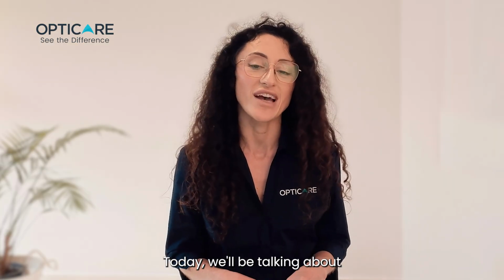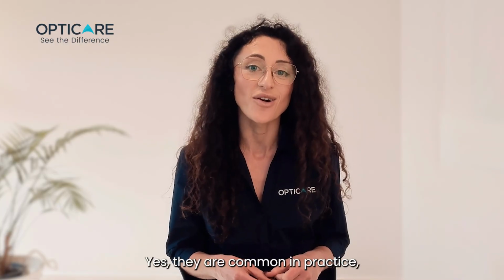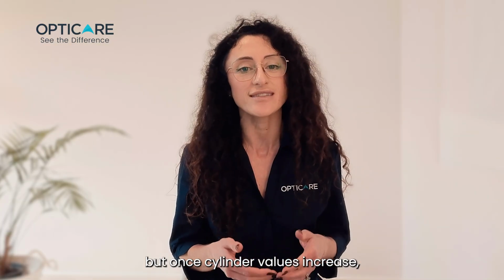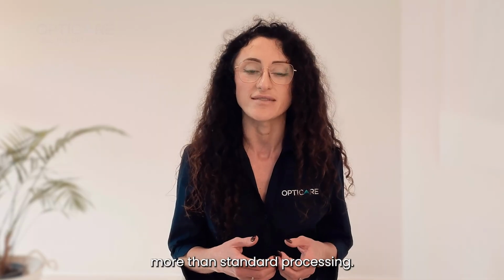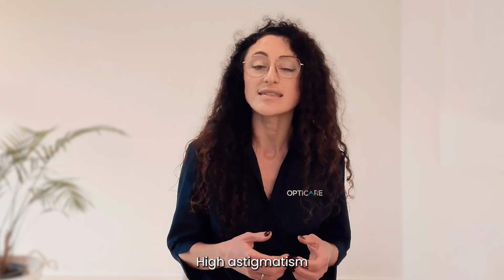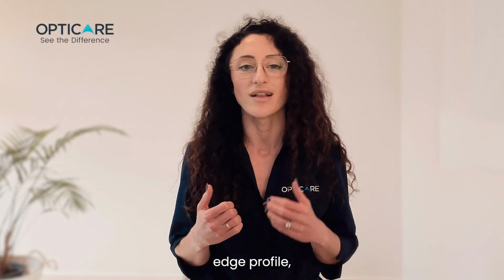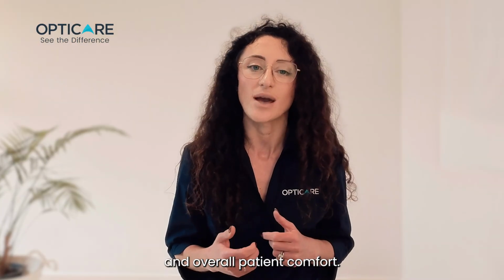Today we'll be talking about high astigmatism prescriptions. Yes, they are common in practice, but once cylinder values increase, these jobs really require more than standard processing. High astigmatism can influence lens thickness, edge profile, weight, balance, cosmetics, and overall patient comfort.